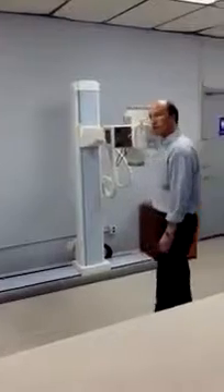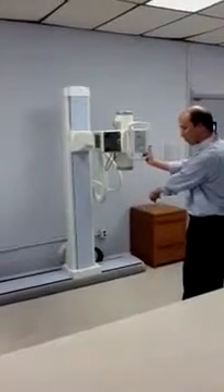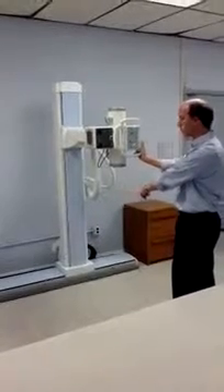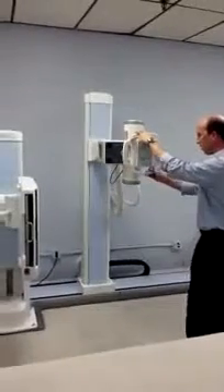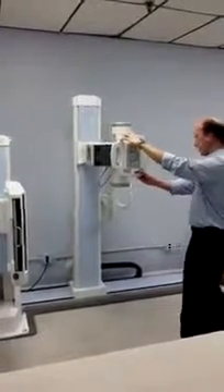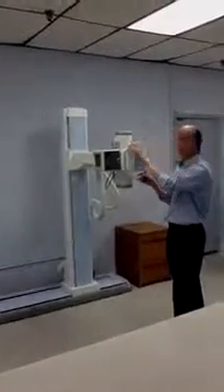The first thing we'll talk about is the tube stand. The tube stand moves horizontally along a floor-mounted track located at the bottom of the tube stand. With the push of a button you can move the tube stand back and forth horizontally very easily. Again, this is a completely manual piece of equipment.